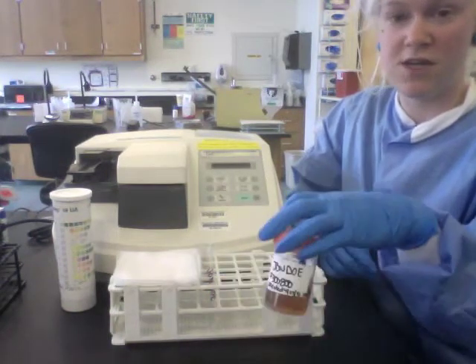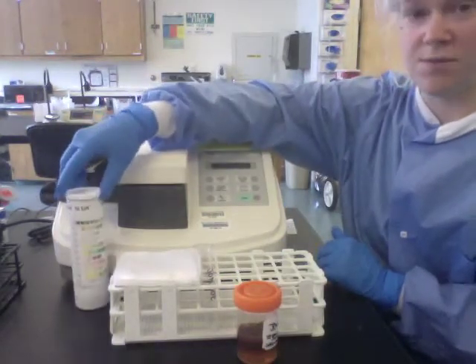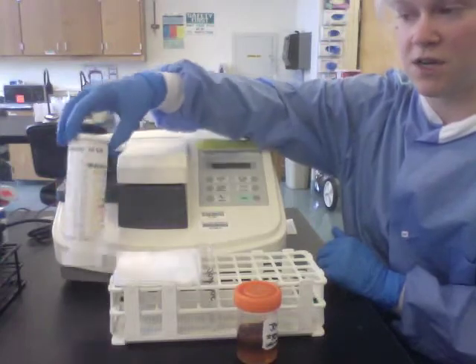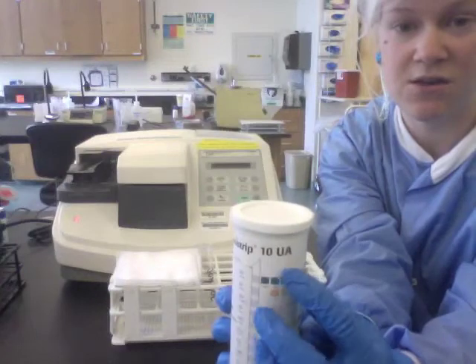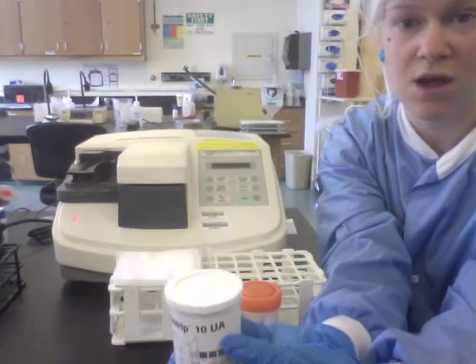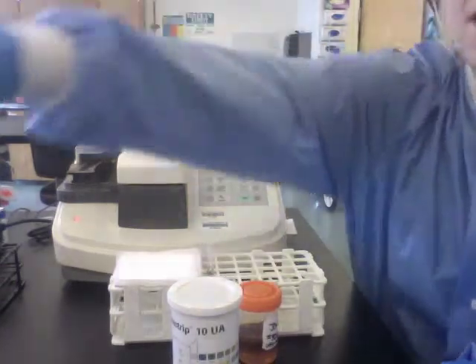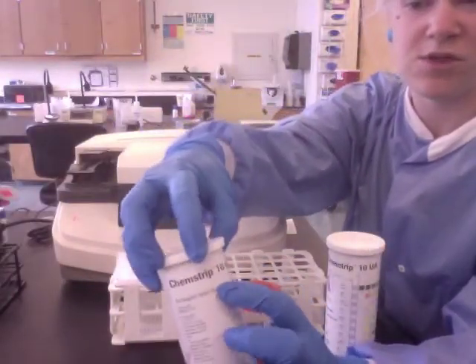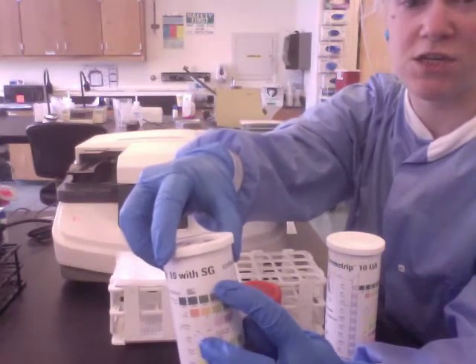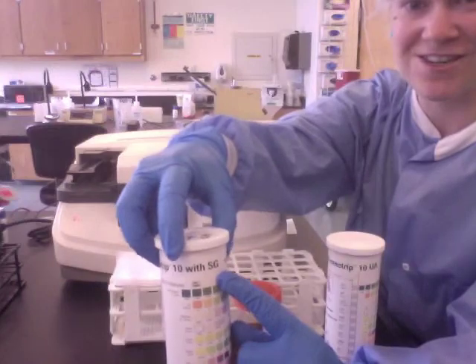First, you're going to need a urine specimen and strips appropriate for the Criterion Analyzer. The Criterion has to have the ChemStrip 10 UA strips. No other strips will work for this analyzer — you cannot use the ChemStrip 10 with SG. They will not work in the analyzer; they will jam the analyzer, so do not use them.